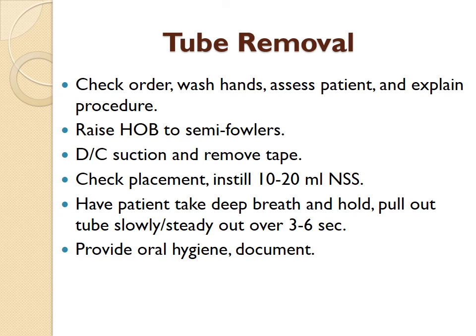Once you've done that, you're going to provide hygiene not only in the nostril area, but also the oral area. Remember, even though the patient has two nares, they're going to tend to mouth breathe the whole time this tube is in place, so that their mouth is going to constantly be dry.